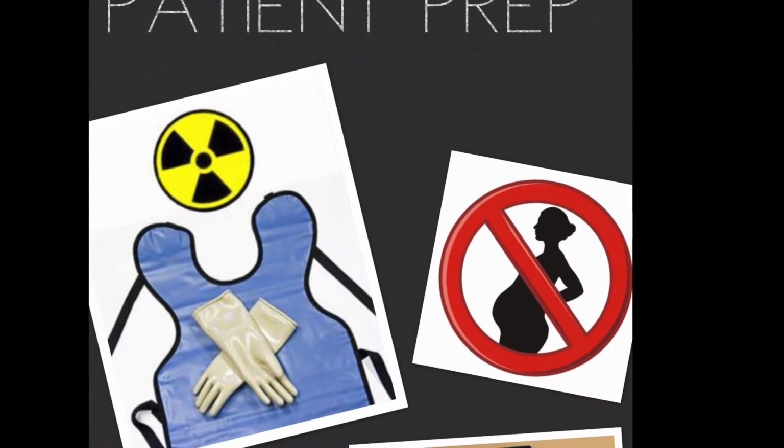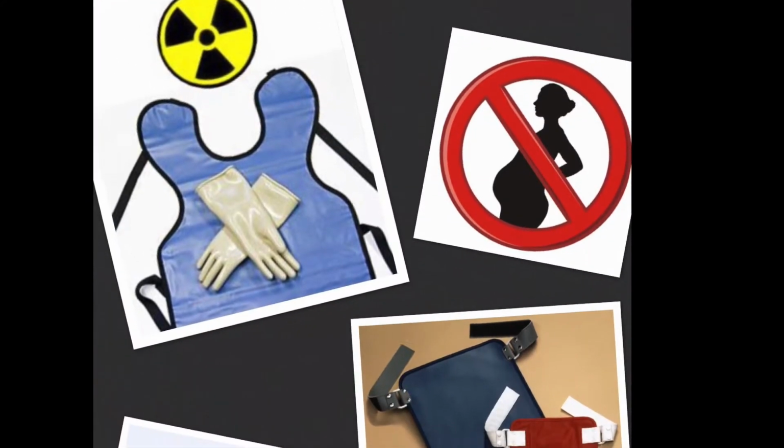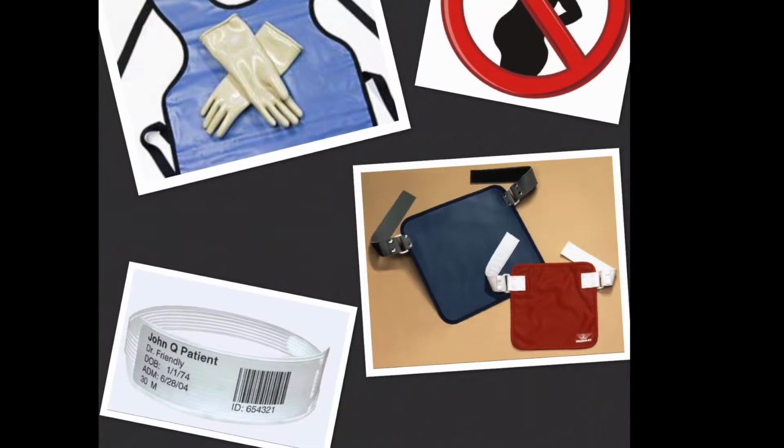When the patient is done changing and ready to begin, you're going to thoroughly explain what you need from them. Allow the patient to talk about any comments or concerns that they may have. When the patient is ready, shield and begin positioning.